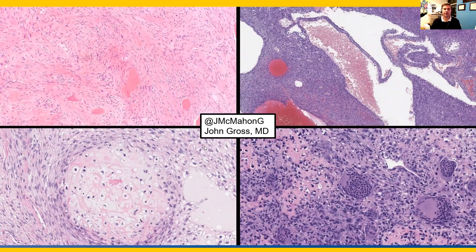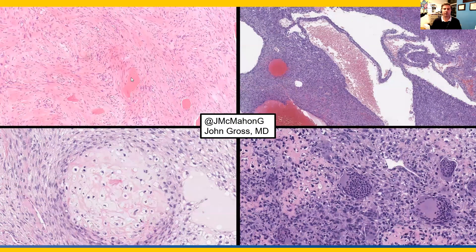Here's a collage showing at the top left a spindle cell sarcoma with variable nuclear pleomorphism — relatively bland but variably pleomorphic — also associated with more well-formed foci of osteoid. This is a fibroblastic osteosarcoma. Notice that the well-formed bone is not rimmed by osteoblasts. The top right is an example of telangiectatic osteosarcoma with blood-filled cystic spaces and fibrous septae, which contain, even at this low power, a highly cellular and anaplastic sarcoma.